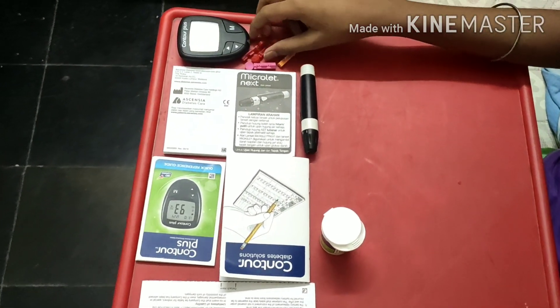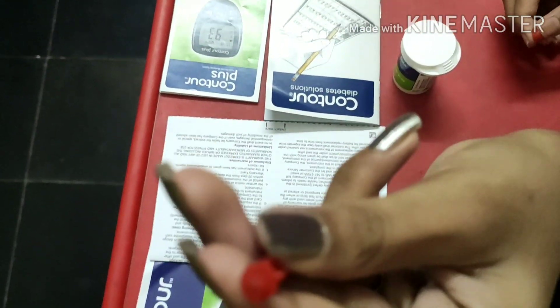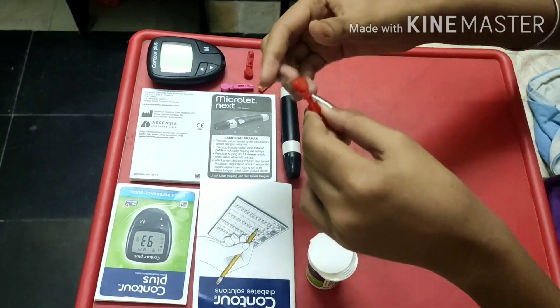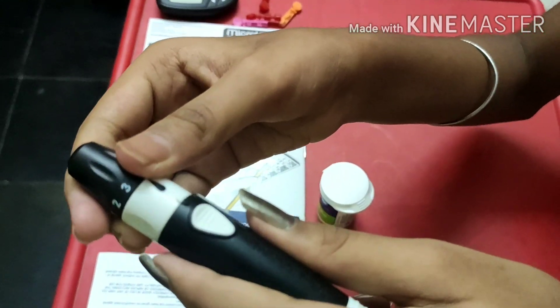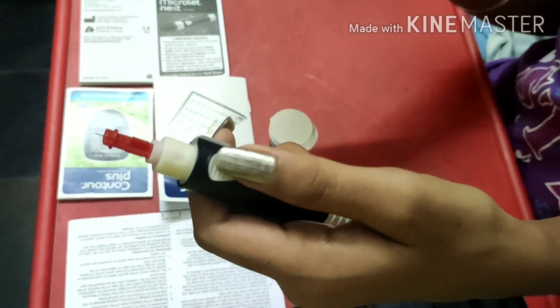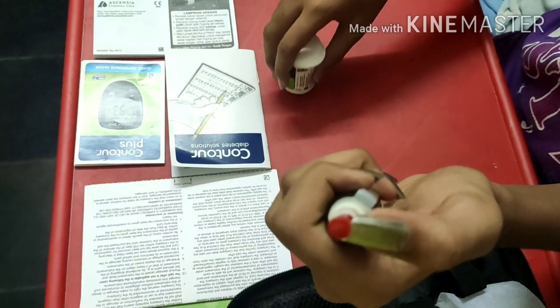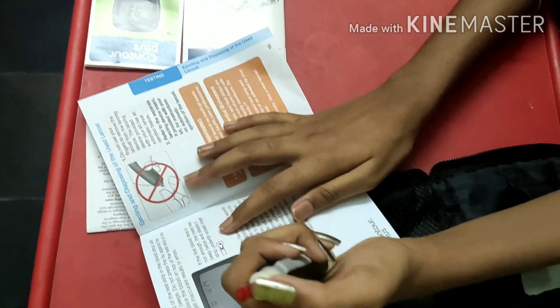I will show you how to use these. For the needle, you should pull it out like this — be careful, don't touch it directly. You should insert this into the lancing device. To open it, you can see there is a mark — you should drag like this and pull. I have already inserted a needle here — you can also read the manual.